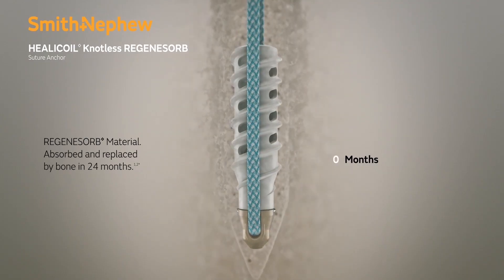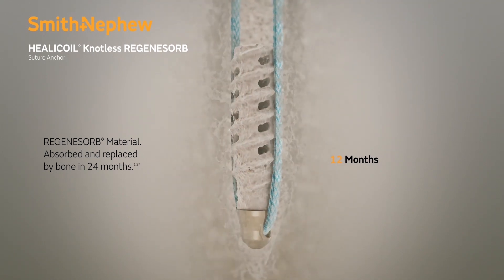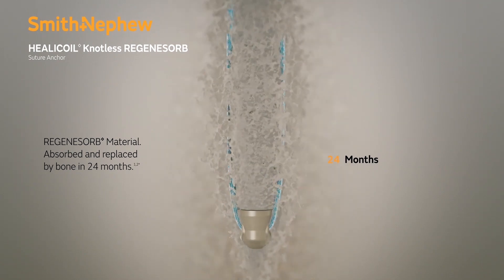The Regenosorb material of the anchor is absorbed and replaced by 24 months. At the time of implantation, the anchor has excellent immediate fixation into bone and suture security.